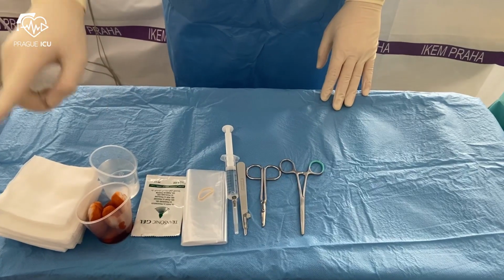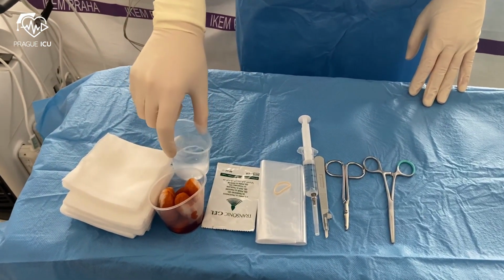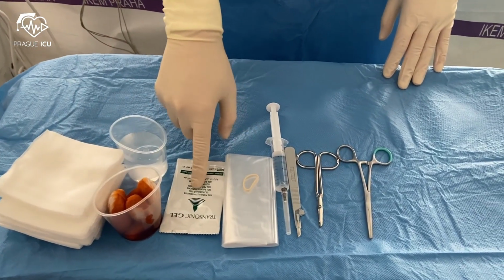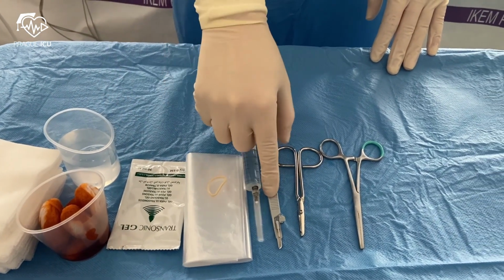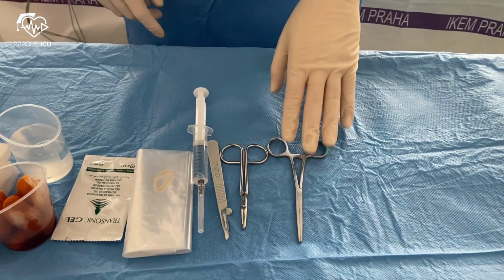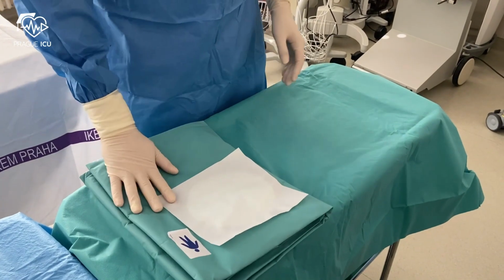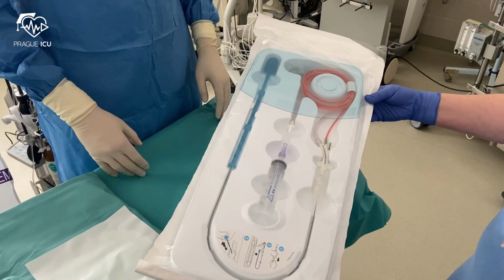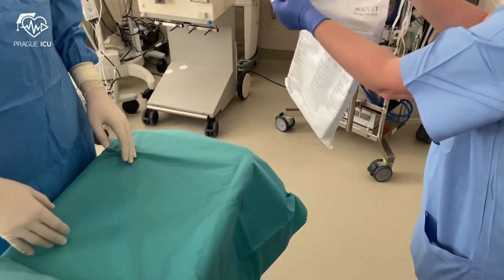On a sterile trolley, prepare a sterile gauze, local disinfection chlorhexidine, sterile probe, cover and gel, needle and syringe with a local anesthetic, scalpel, scissors and clamp. On a second trolley, prepare a large fenestrated sterile drape and balloon pump components that consists of two parts.